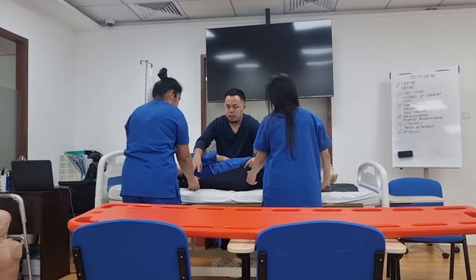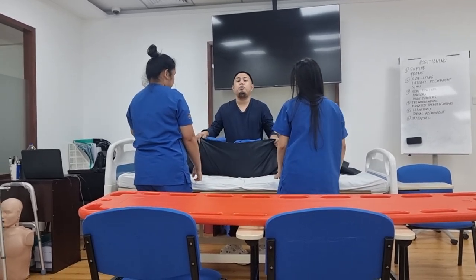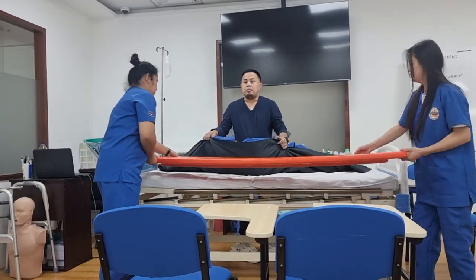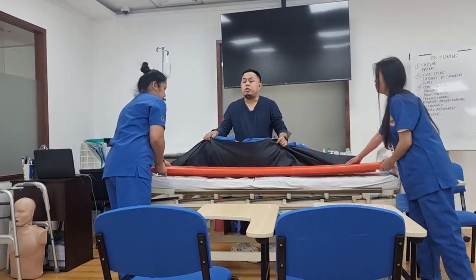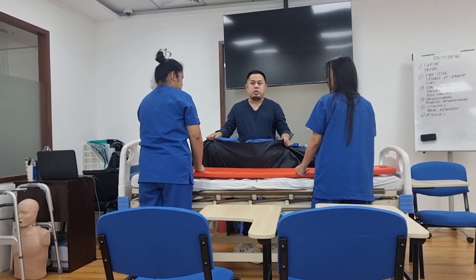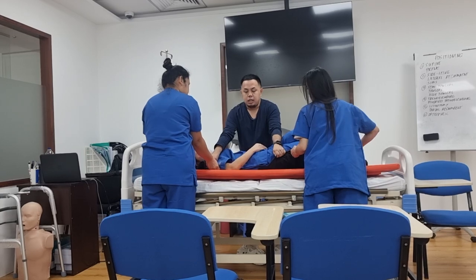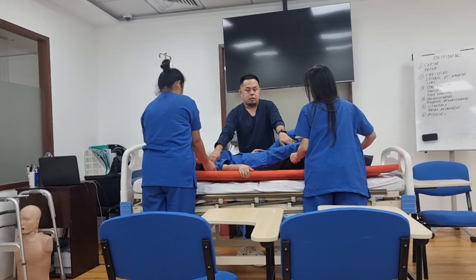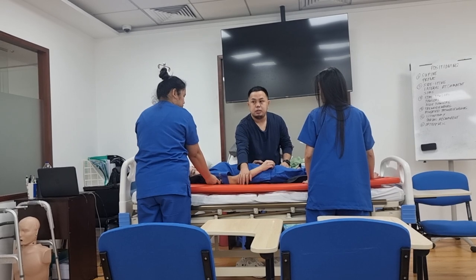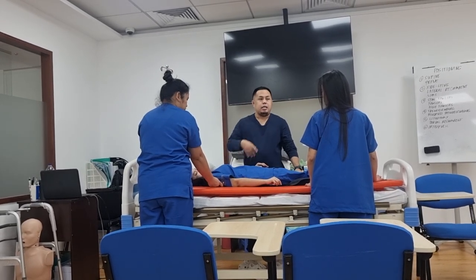Hold the patient, then tell your colleague: 'Can you bring the board from the stretcher bed to the patient's bed?' Once the board is already on the patient's bed, roll the patient back towards the center. At this point, half of the body of the patient should be on the board and half still on the bed.